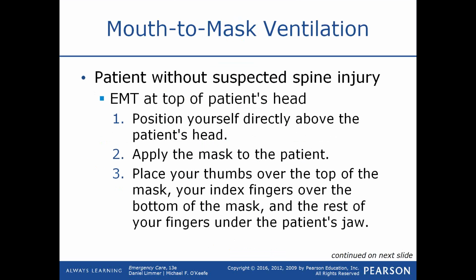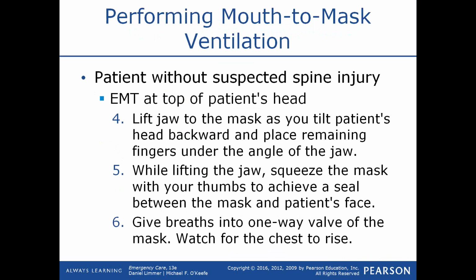There's also another technique out there called the thenar technique, and that's where you take just your thumbs and place them over the top of the mask, and then use your remaining 4 fingers to grab the jaw and lift it up off the back of the throat. So lifting that jaw to the mask lifts the tongue up off the back of the throat, and then that allows you to have your partner squeeze the bag.